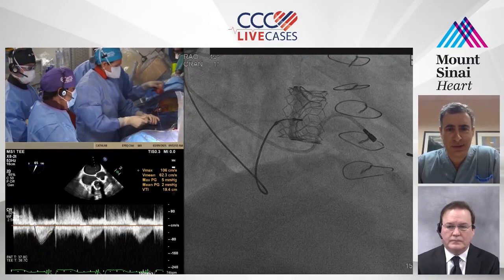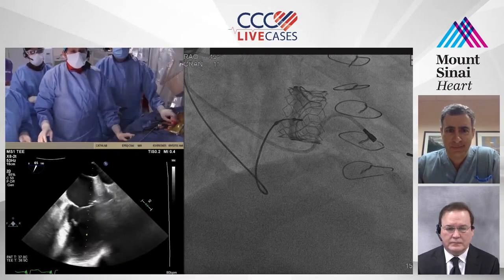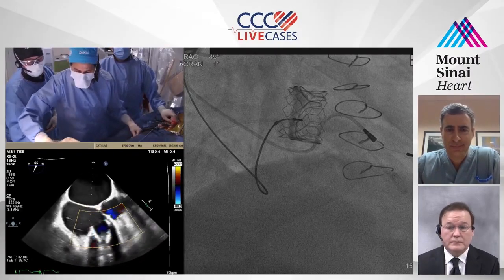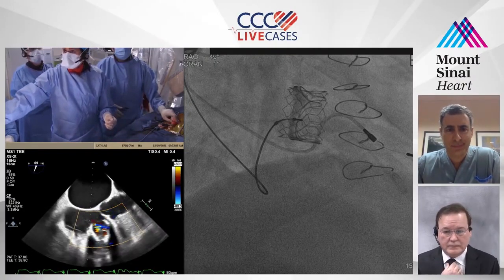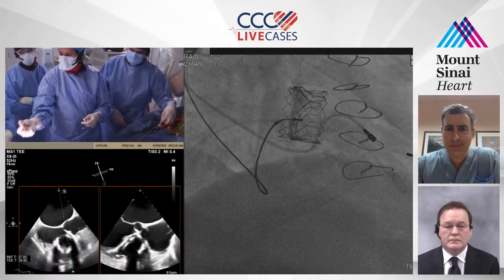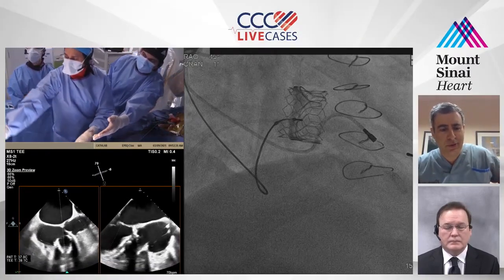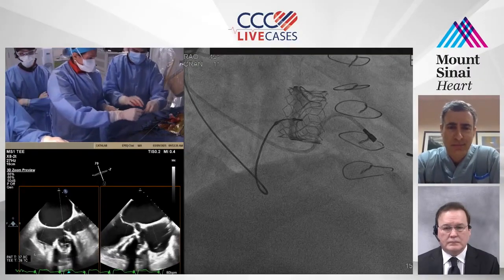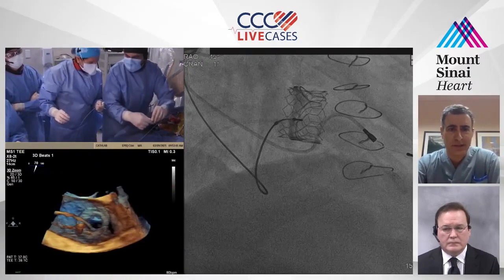I guess the question now is, is he going to get anticoagulated or can't he tolerate that? Yeah, he was not able to tolerate it even before, despite AFib and all, because of the severe bleed. So he had not been on any anticoagulation. So the question is, otherwise routinely you would do anticoagulation, right? Yeah, we would. In someone who's really at high bleeding risk, we've had some good success using DOACs like apixaban. Maybe that could be considered at low dose because you want this valve to last as long as possible.